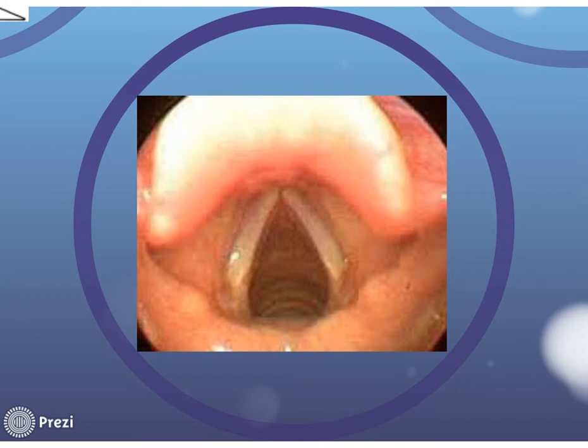It's not really focused enough for me. I'm not going to commit to that. But I do know this. I have a great glottic opening. I'm going to get the tube in that hole. I know this, and I can see the epiglottis. I can see the cords. So I'm not going to get caught up on whether I see the bones or not, because at this point, the bones don't matter. I've got a great glottic opening. Who cares? But from your perspective, you need to be able to name those things because we expect you to know. All right, enough.